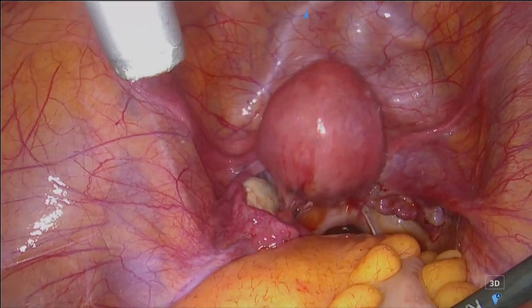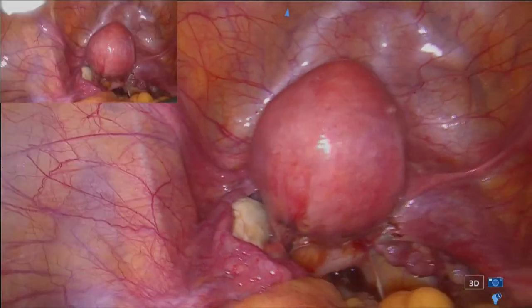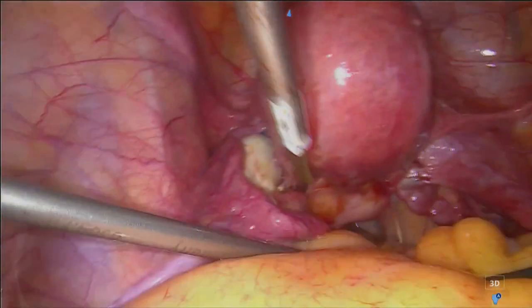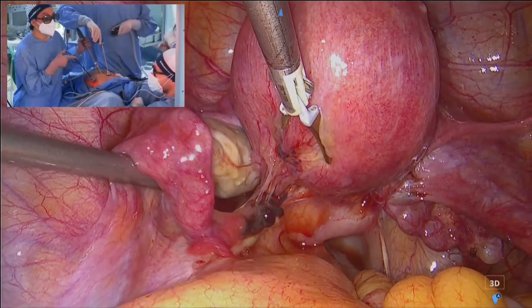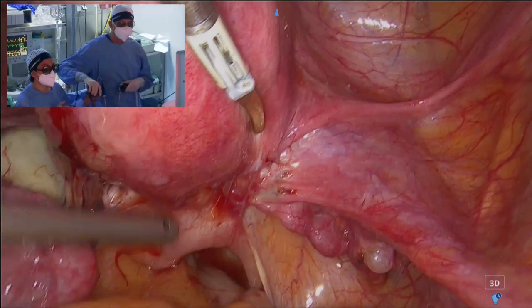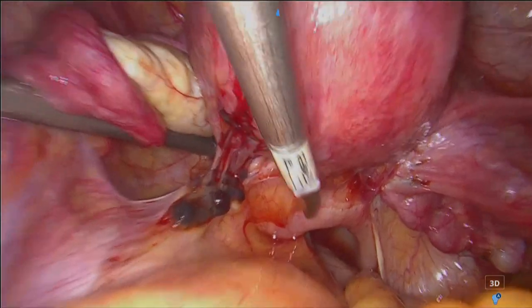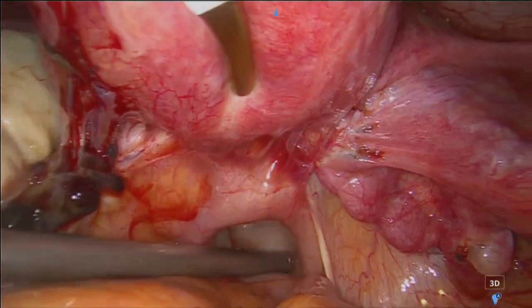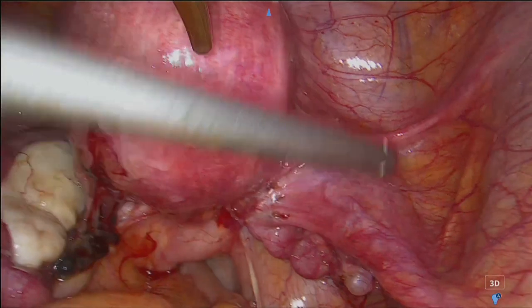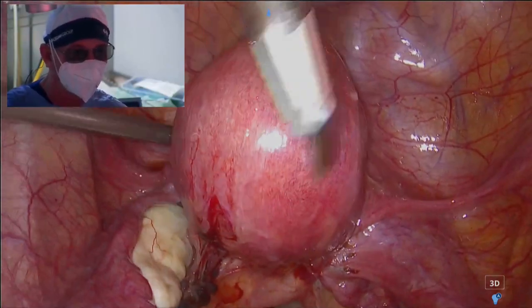and we try to mobilize the uterus. It is very difficult because of the presence of this nodule in the posterior area that we know from the preoperative ultrasound evaluation. So I will try to explain the situation. These are the adhesions on the left and the situation on the right. We have confirmation of the adhesions between the ovary, tubes, bowel, pelvic sidewall and uterus. So T is 2-2 on both sides, confirmed. And obliteration of the pouch of Douglas is confirmed. Here we have the big nodule starting from the retrocervical area, infiltrating the parametria and then the anterior wall of the rectum, and confirmation of the area of adenomyosis in this part of the uterus.